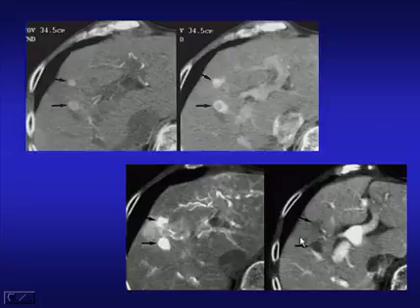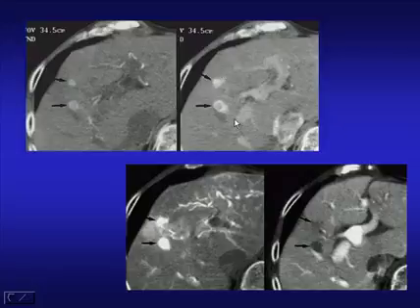This involved arterial cannulation when transferred to the CT scanner and rather fell out of favor. And we can get almost as much information today with modern CT scanners from a rapid intravenous bolus, although there is some blurring between the two, the arterial and portal venous phases, but with practice diagnostically we can do almost as well.